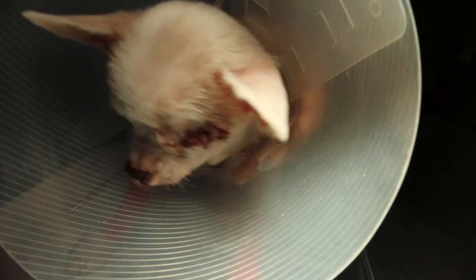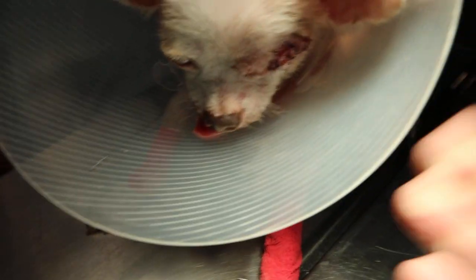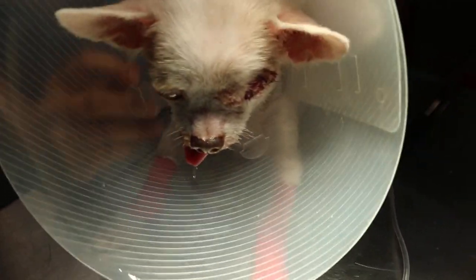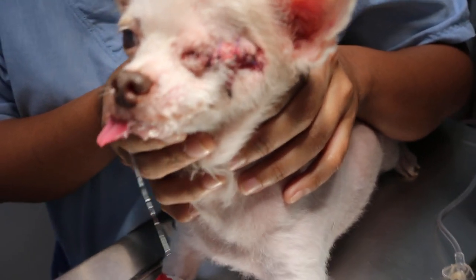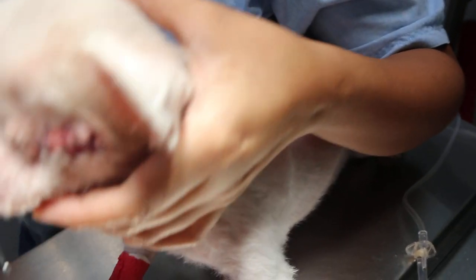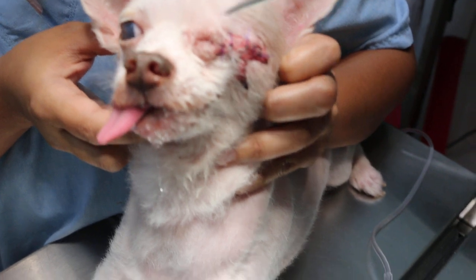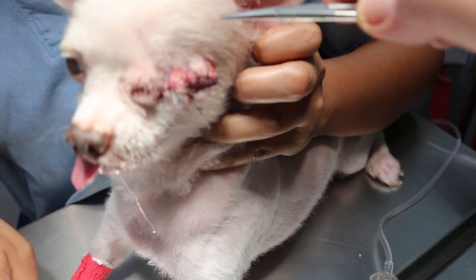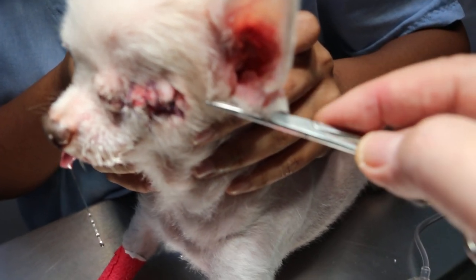There was not much bleeding because I ligated the optic nerve plus the blood vessels. Without ligation there would be a lot of bleeding. It's very important to ligate the optic nerve and blood vessels. As you can see, there is practically no bleeding now. The medial canthus is not cut off — you can see this part here. This allows fluid to flow out; if everything were closed, nothing would flow out. The lateral canthotomy has also been stitched up, about one centimeter, and this is the lid margin.